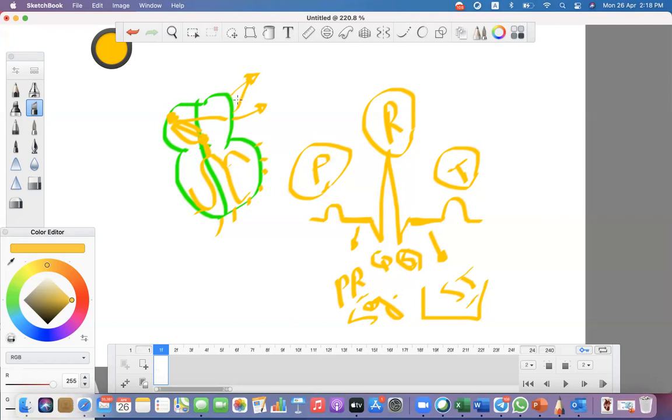So the small wave of atrial relaxation is hidden in the large QRS wave of ventricular depolarization. So it is hidden in the QRS. So I cannot see it from the standard ECG, right? Okay, great. And as we said before, that if we add a wave plus a segment, I can gain what is called an interval.